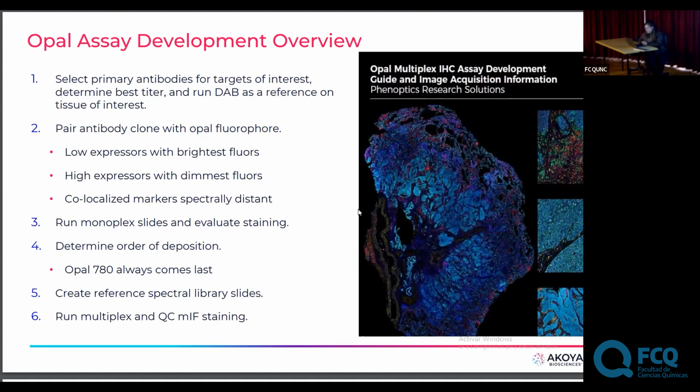Next would be to prepare your spectral library slides and create those in inForm. And after that, we'd be able to run your multiplex and QC your imaging.